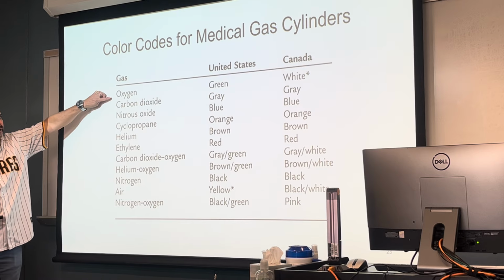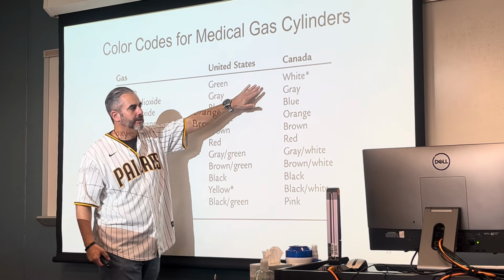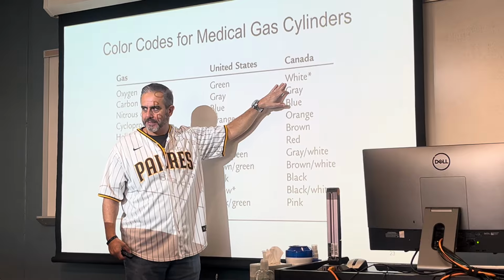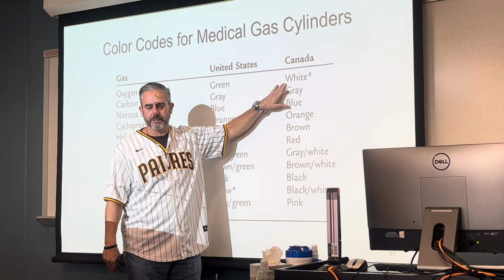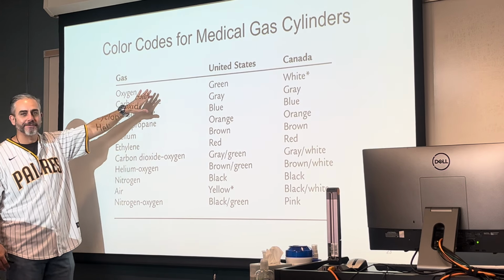For example, an oxygen tank in the United States is green. In Canada or every other country, it is white. We've got to be different. Well, of course we've got to be different. We've been different for a long, long time. This is nothing new.